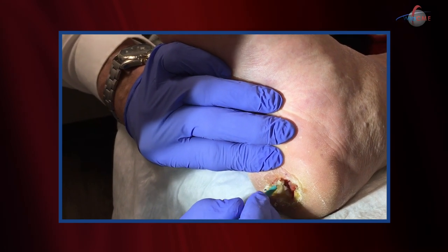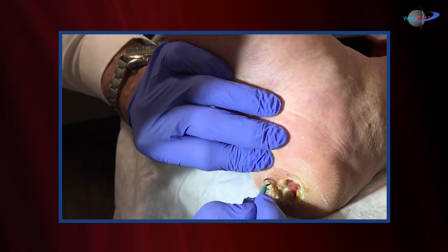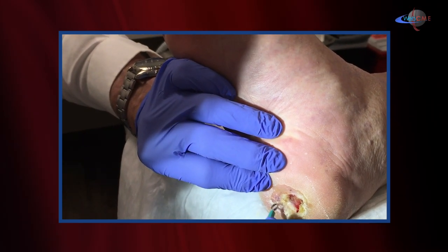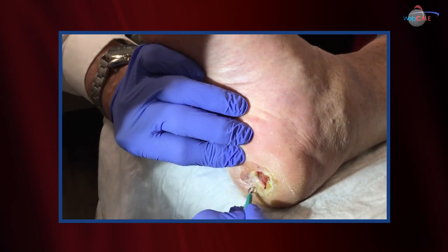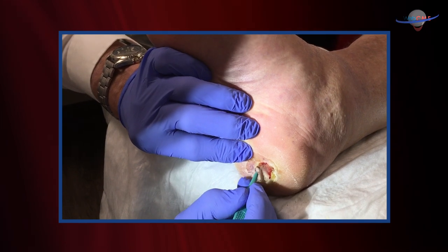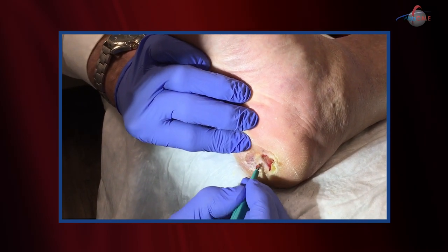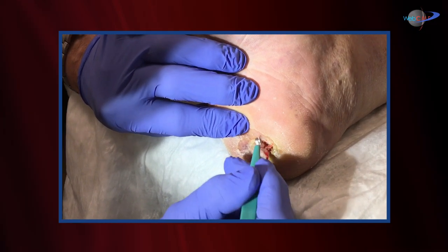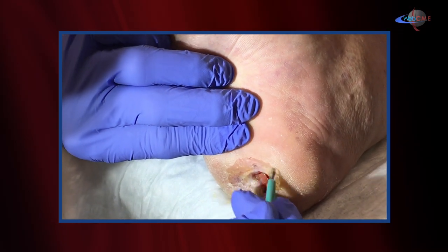Obviously we need to promote granulation tissue, and we'll do that through a variety of topicals. But the bane of a diabetic's existence is the development of this callus. Their neuropathic ulcers are insensate — they don't appreciate the amount of callus that they're actually walking on. This can be due to trauma or just inadequate offloading. We'll take that callus down and allow better development of the granulation bed and then eventual epithelization. Debridement is important, but offloading is also critical, and that's where the total contact cast will come in.